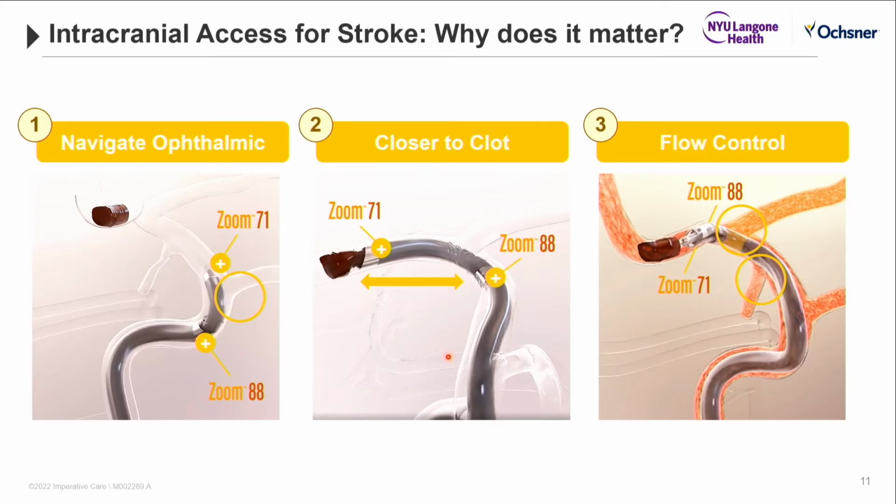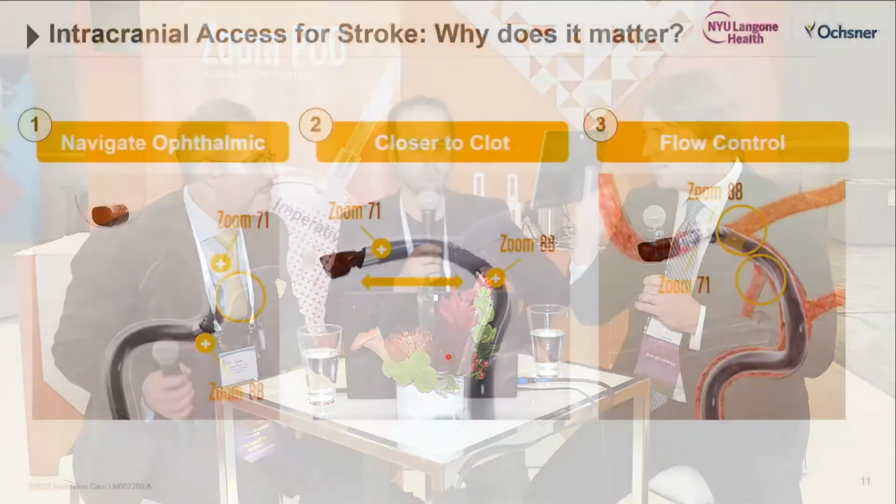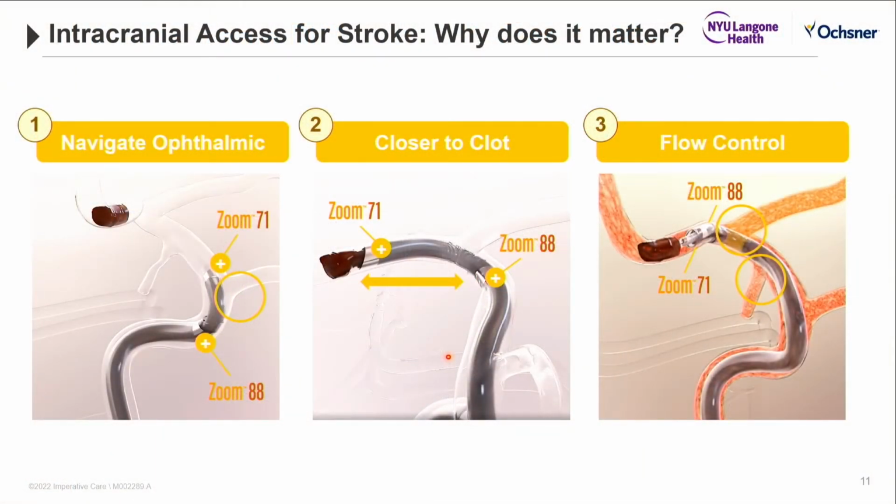First of all, as we all know, what can be challenging about a stroke case with aspiration is getting that initial catheter beyond the ophthalmic, and occasionally it does catch on a big ophthalmic lip. What we used to have to do was manipulate the distal catheter and wire to try to get it beyond. Now what we can do is bring up the 88 or the other catheter and the guide, and that will actually deflect it off of the ophthalmic wall. It might take a couple maneuvers, but it works almost every time if you do have this problem. So that's a great advantage. You don't have to mess with the distal intracranial wire and catheter.